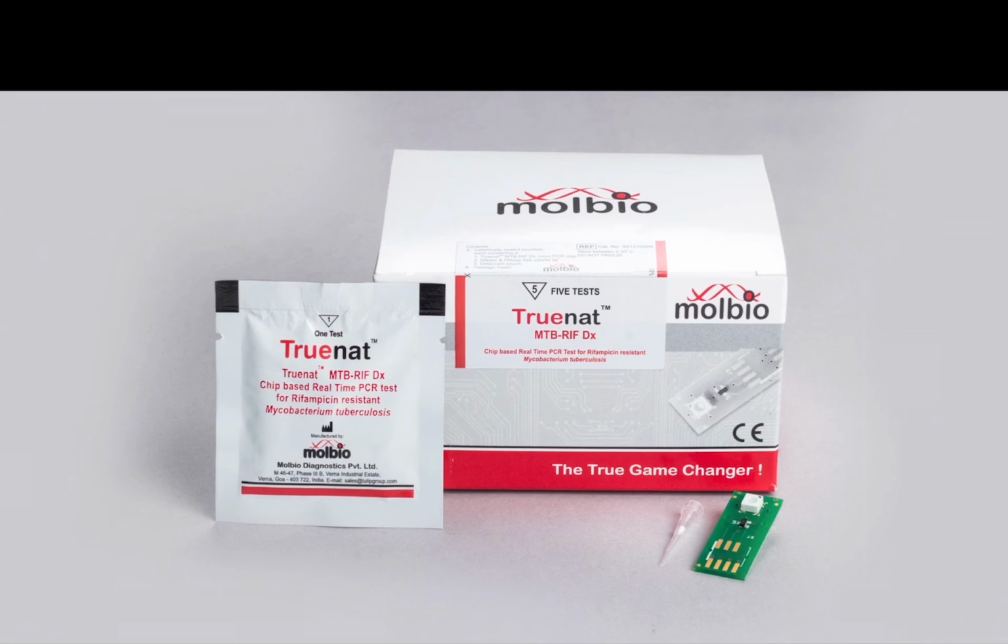You should not use this test first and then do that test. First the MTB test should be done. Then only this particular test has to be done, only when MTB is detected. For a lab technician with a lot of work, doing multiple things at a time, sometimes by mistake he'll use the other chip. That is why the writing here is entirely red: MTB RIF DX. Whereas in the MTB chip it was black. They have added this benefit by putting the entire thing in red, so you realize this is a RIF chip.